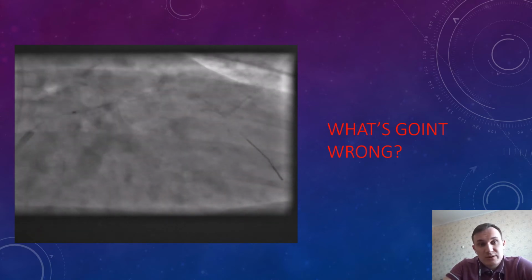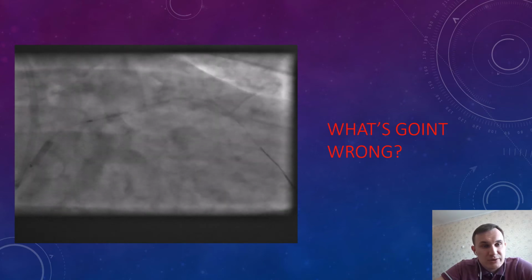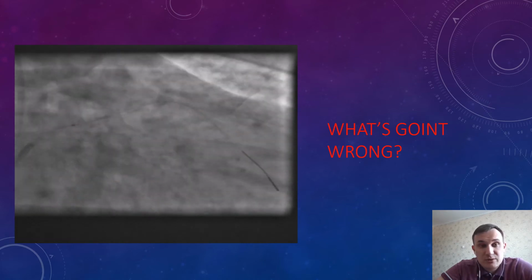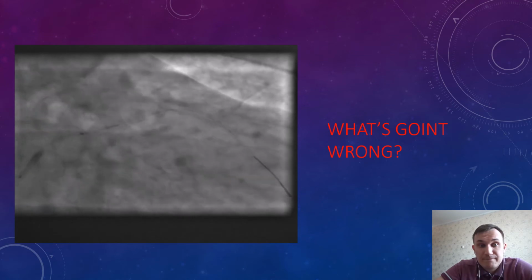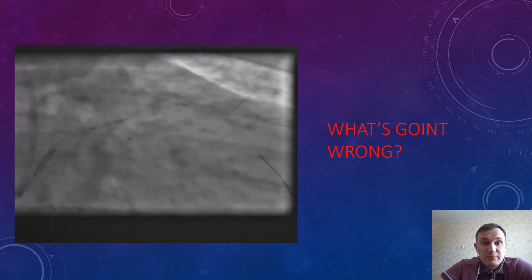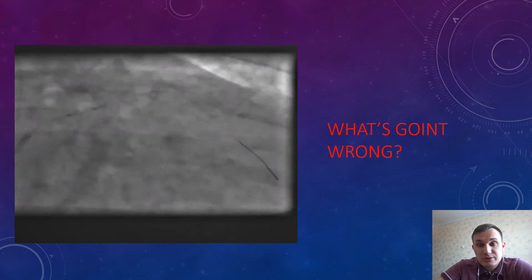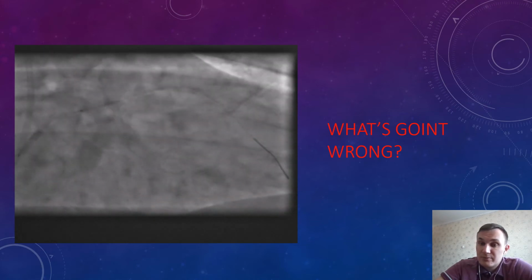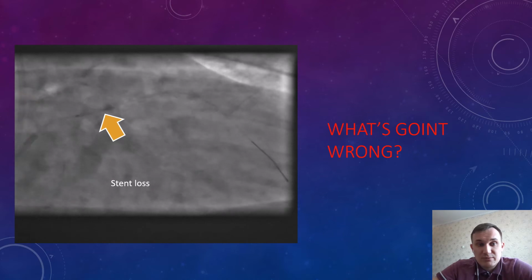But what was wrong with the next step? In this angio, you can see some kind of material in the proximal LAD and left main, and practically it was the stent which we couldn't deliver to these lesions, because I don't know, maybe due to inappropriate preparation of the vessel, maybe due to our manipulations with the guide catheter which engaged too deep and damaged proximal struts of the previously implanted stent, I mean the stent of proximal LAD. And you can see the dislocated stent from the balloon.